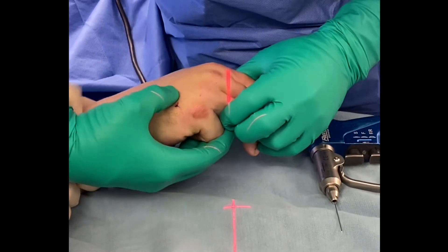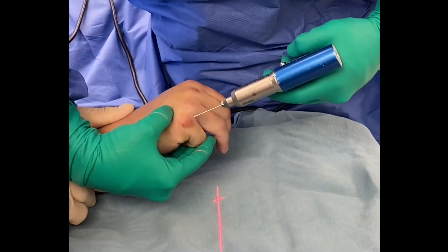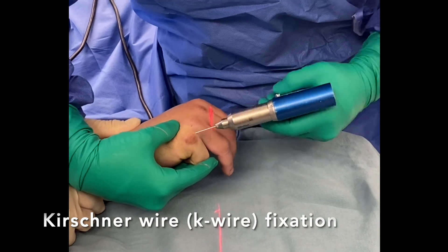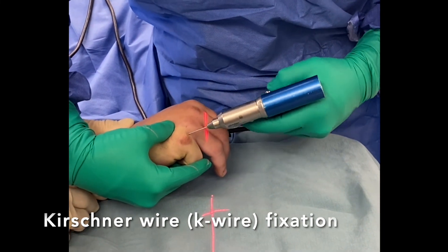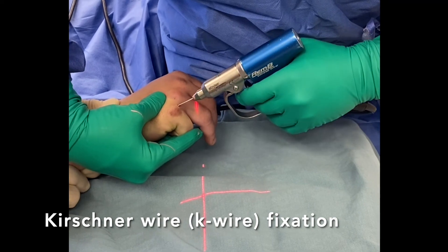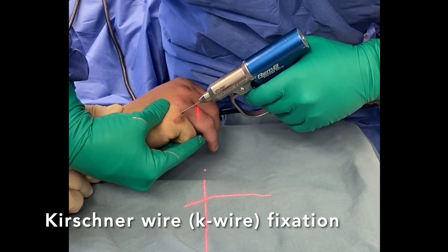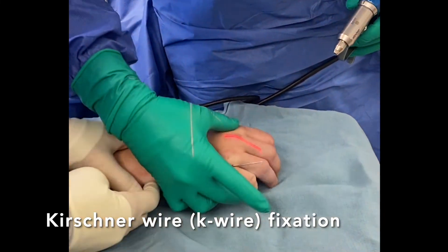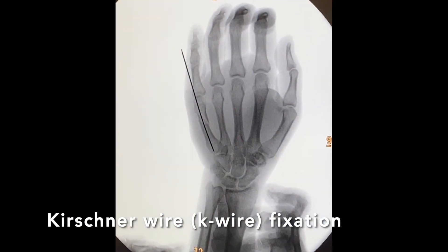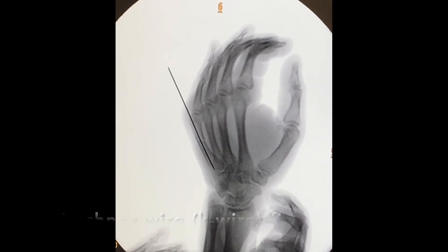Before insertion of the K-wire, the fracture is reduced as demonstrated here. While holding the fracture in alignment, a K-wire is drilled percutaneously down the intramedullary canal of the fifth metacarpal. After K-wire fixation, x-rays are taken to ensure appropriate reduction and fixation of the fracture.